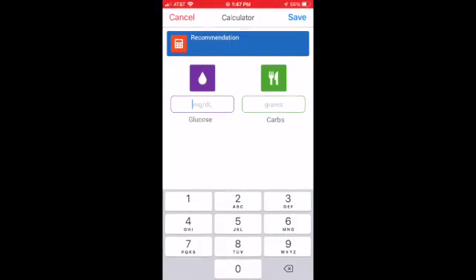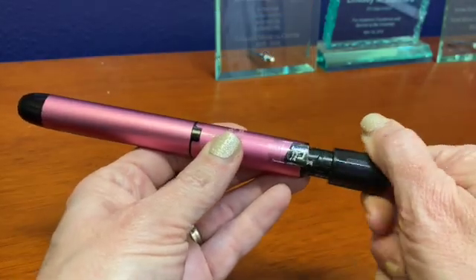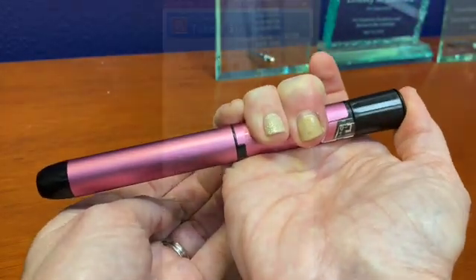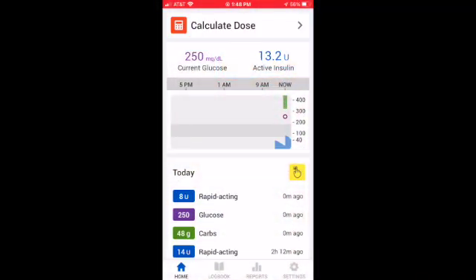When you use it, it's Bluetooth connected to an app. That app does all of the math for you about what your dose should be. Once you dial up your dose and push it, it registers on the app how many units you took, what time it was done, and how long that insulin will be active for.